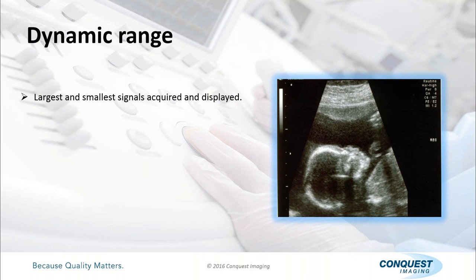And the dynamic range is simply saying, what is the least dense material that we can accurately represent in the image area without it being completely and totally black? Or what's the highest density material we can represent as white without it being blossomed and overwhelming? So that variance from the least dense to the most dense material is called dynamic range.